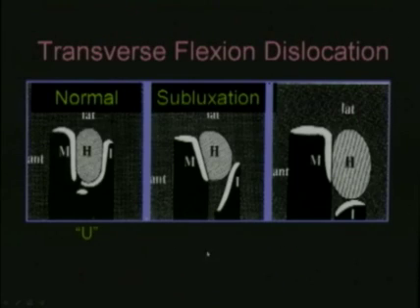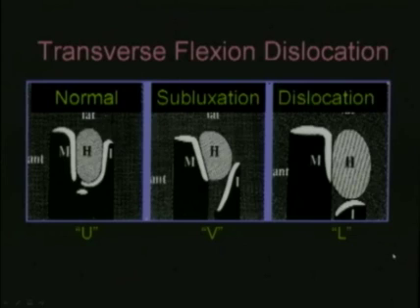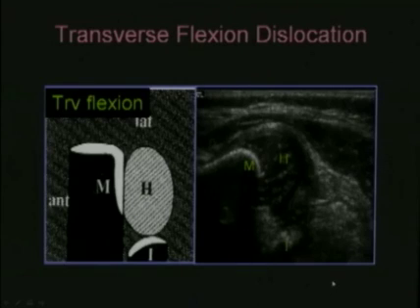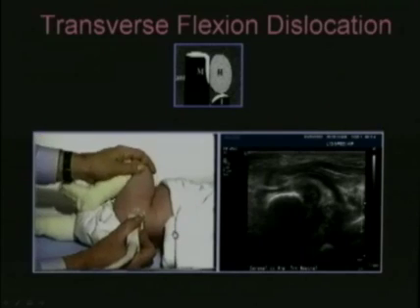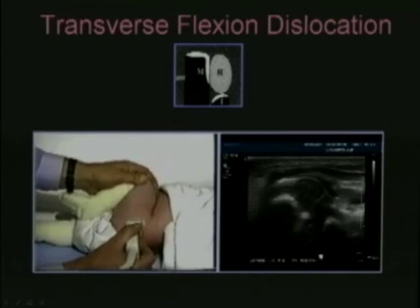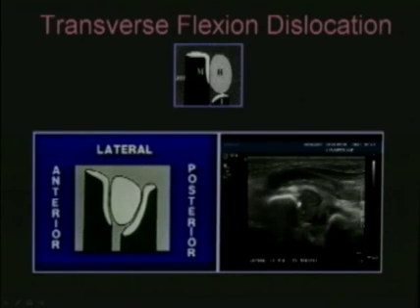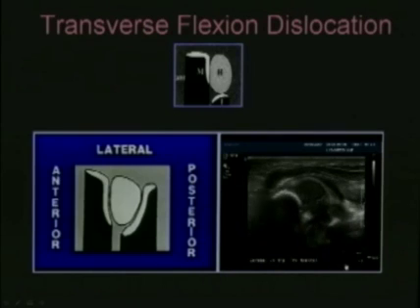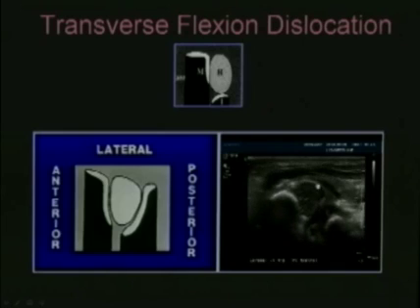The progression goes from normal — the U-shaped cup — to the V-shape in subluxation, and finally with dislocation to an L-shaped configuration. With dislocation, there is no acetabulum alongside the femoral head. On ultrasound we see the metaphysis and L-shape, with the ischium visible but the head not in the acetabulum at all. In this very shallow acetabulum, the hip is only in a more normal position during abduction and external rotation, but we can show the hip is reducible — a very important finding for deciding if a Pavlik harness is appropriate.